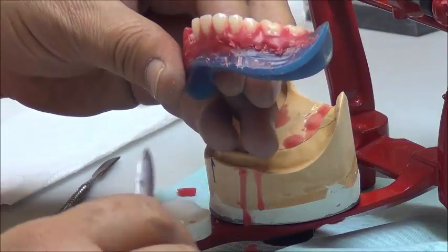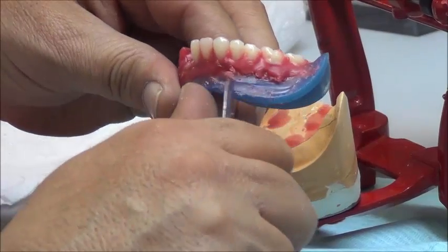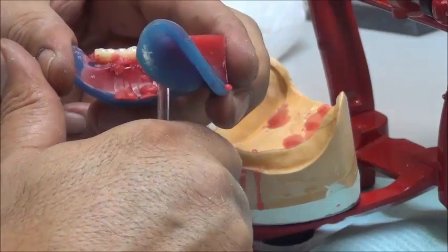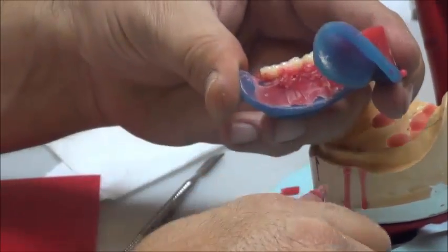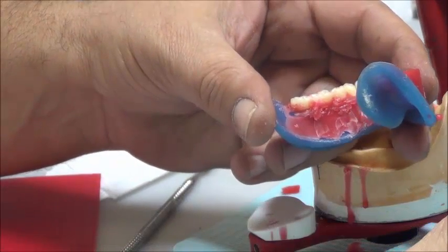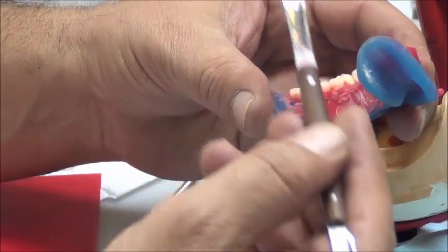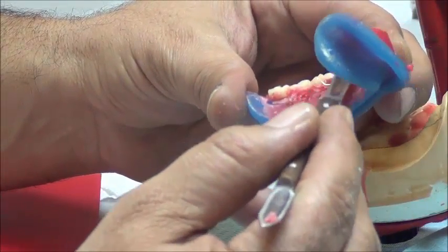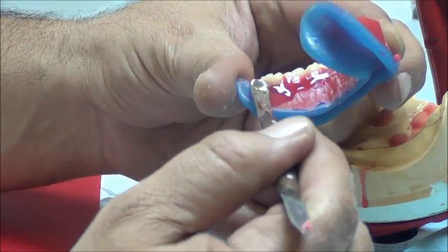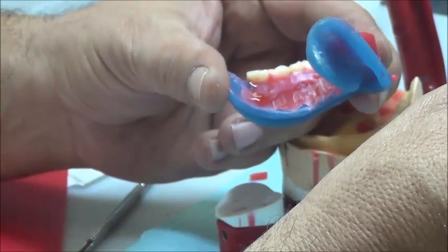So now we're going to begin the cleaning of the wax. Make sure that the fitting surface and the sulcus is totally clean. The sulcus should be totally clean from any wax. And that makes, once we finalize the wax on both sides, we are now ready to do a step called wax up or festooning, which is adding wax to mimic the gingival tissue around the teeth.